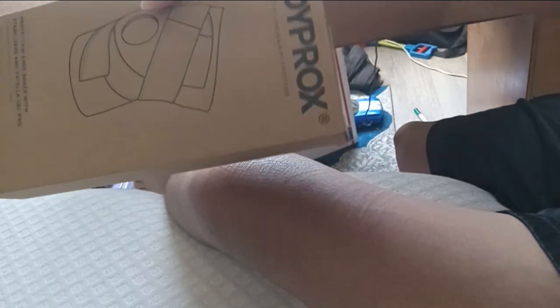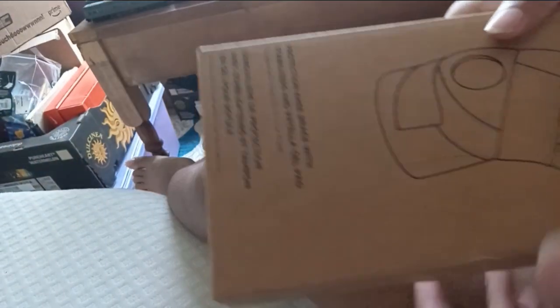What's up guys, D-Gen here and I finally got my knee brace. It just came in from the mail. So without further ado, let's just open this up.